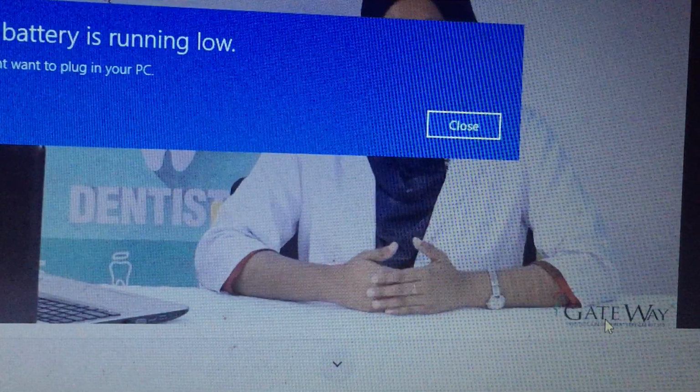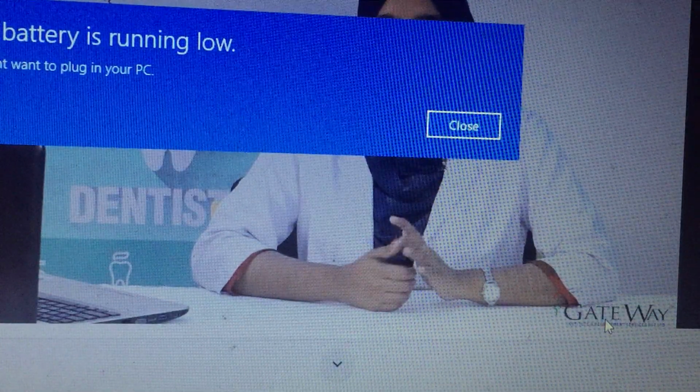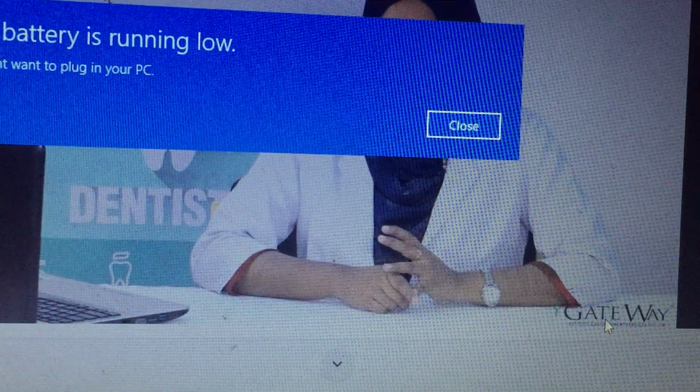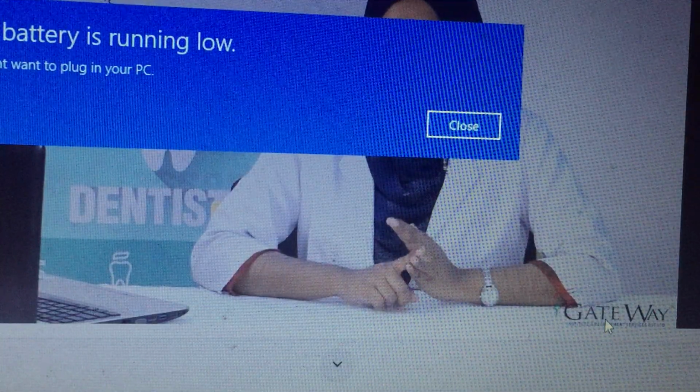So the points under instrument activation are: first adaptation, then angulation, then lateral pressure, and stroke. Stroke can be three types. First one exploratory stroke, a light feeling stroke for exploring. Second one scaling stroke, a short and powerful stroke for scaling.